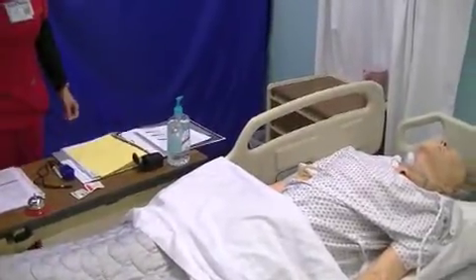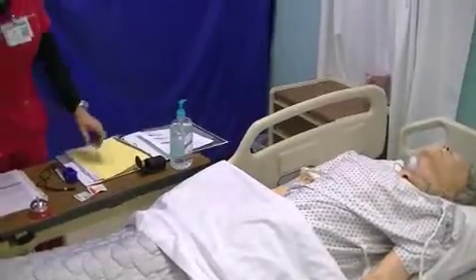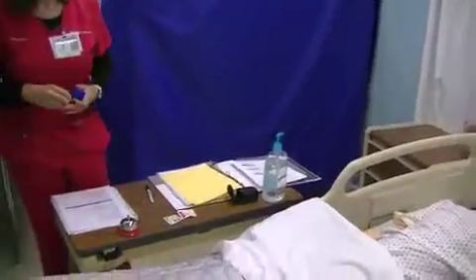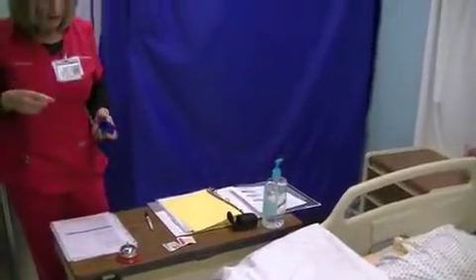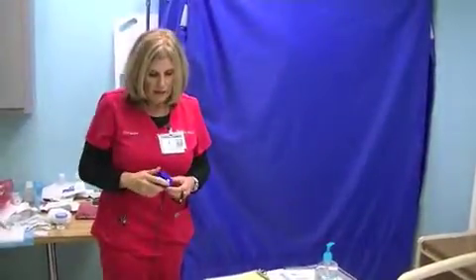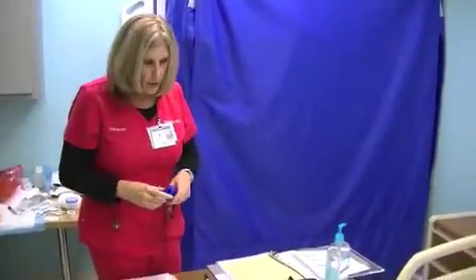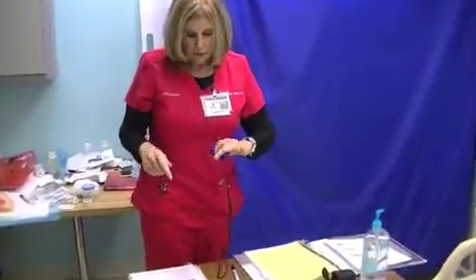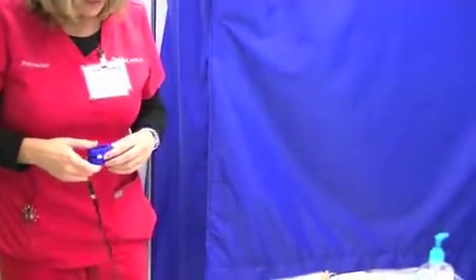Also, we're going to determine the optimal level to do the oximeter. This particular oximeter that I have is a fingertip oximeter. They make ones that go on the earlobe, and they also go on the forehead or the bridge of the nose, but the fingertip is most commonly used. So I'm going to start out by checking the capillary refill next to where I'm going to take the pulse ox, because we need to make sure we have good blood flow before we're able to take the O2 saturation.